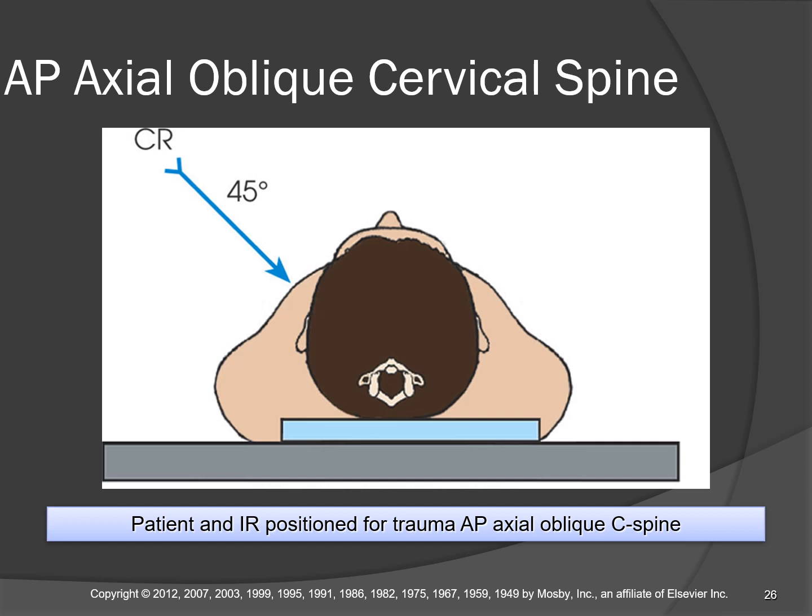And so you shoot this non-grid 45 degree central ray to the body part and the image receptor. Notice this obeys one of the rules. If we have to sacrifice the orientation of the anatomy to one of the external objects, we're sacrificing its orientation to the image receptor while we preserve the orientation of the central ray to the anatomy, okay? Because the intervertebral foramen opens because the x-rays are traveling right down it, okay? So if you come in at a different angle, it's not going to work, okay?